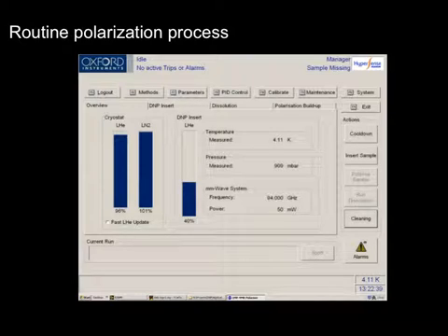But there have been some issues with that in the past that resulted in, for example, the dissolution solvent being shot into an empty bore, which is not a good thing to have to deal with. So again, this is a significant vulnerability of the system that we want to highlight and make sure that we're paying attention to.